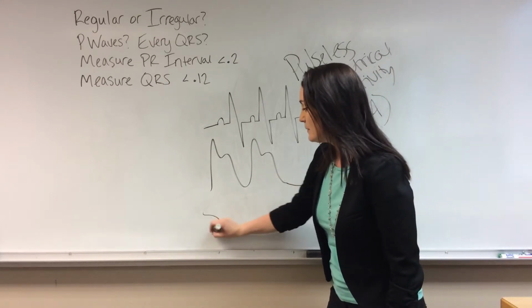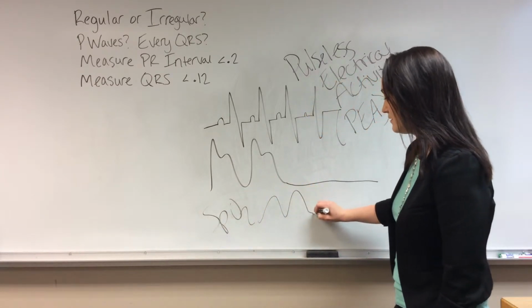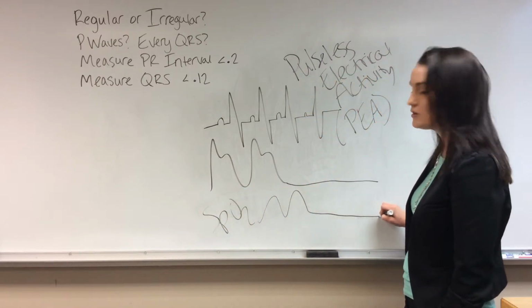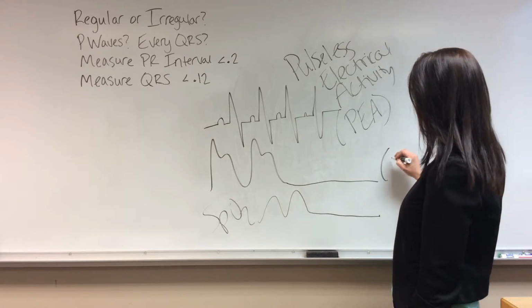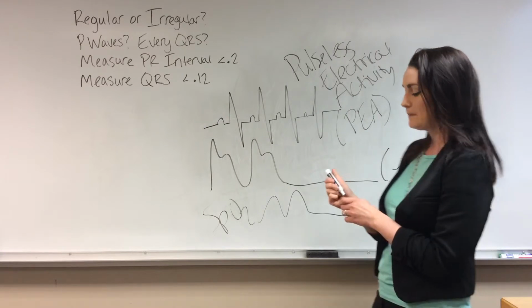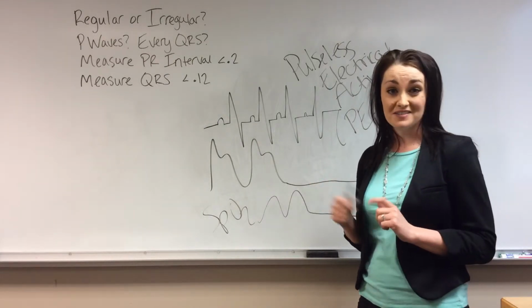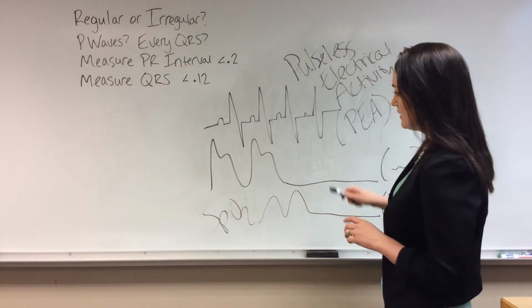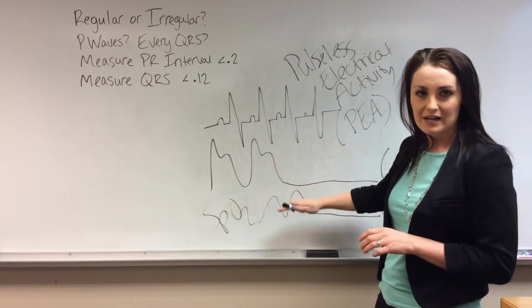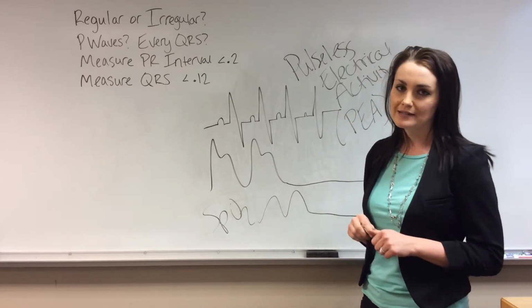And then your SpO2 will just go to nothing. You'll get random numbers, maybe a question mark. And in critical care, when we see that, we jump and we run to check, because something happened here. And it can be that it's pulseless electrical activity.